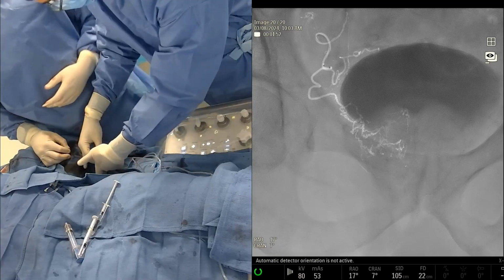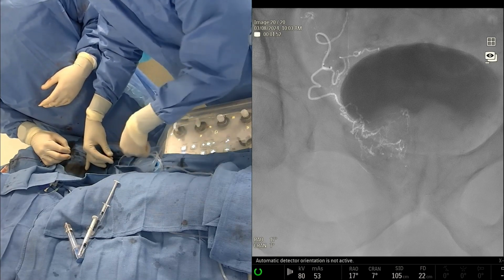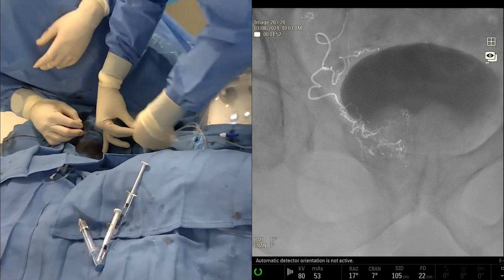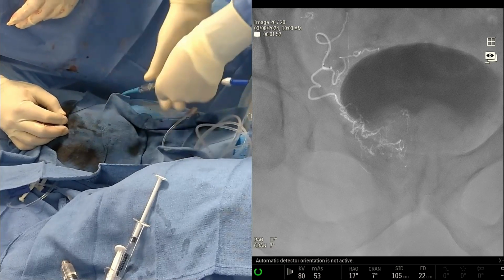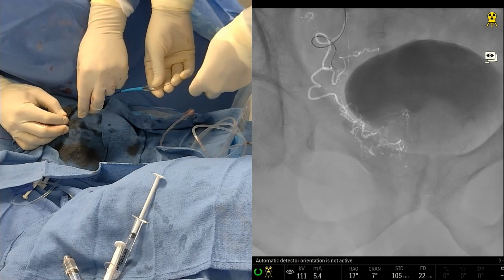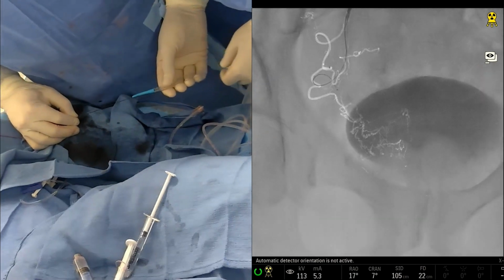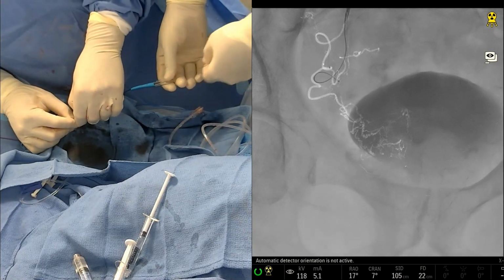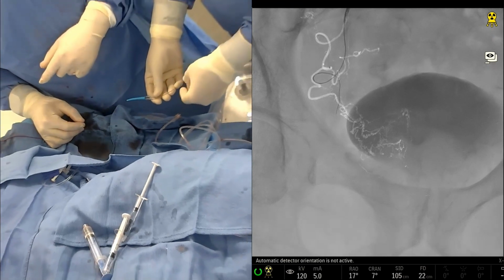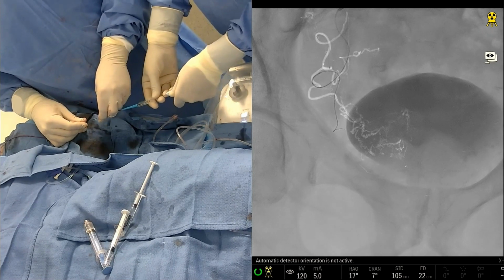Thank you. Not bad. So one of the things I noticed when I looked at that angio very quickly was that the bottom part of the prostate is not filling on that angio. So most likely that's that piece that we saw off the rectal. Which everybody noticed that there was something. That looks like the superior branch. Let's bring this back a little. The roadmap's not going to be accurate anymore. But that little piece at the bottom of the prostate, which we see on that image there, that might be it, right? Let's track and see what that is.